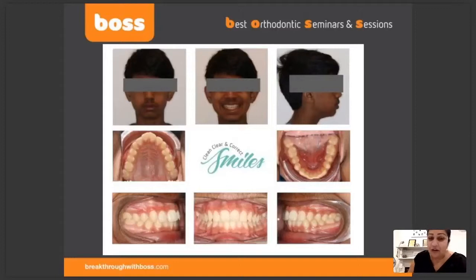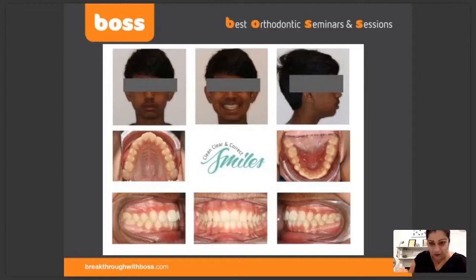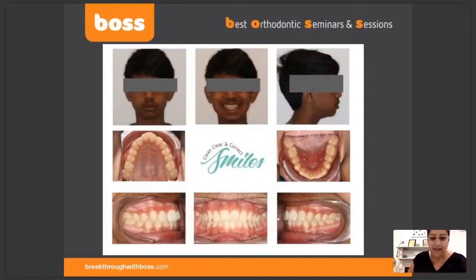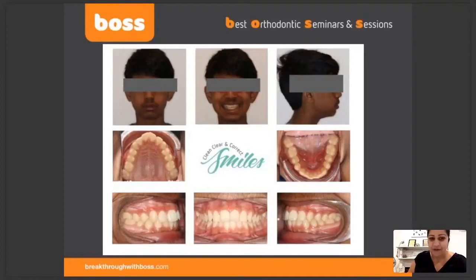Buccal shots — you're coming at a 90-degree angle to the canine and parallel to the floor. Please do not come from the front or too far back. Again, frontal occlusal plane parallel to the floor. These kind of photographs are what you need.